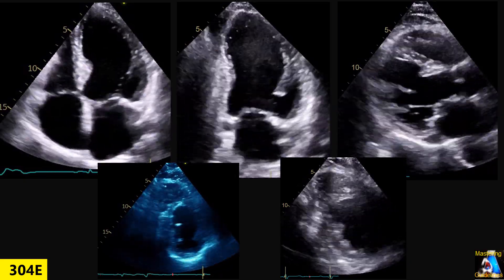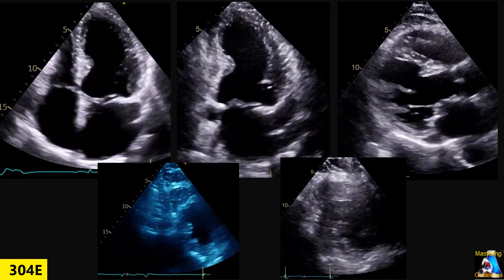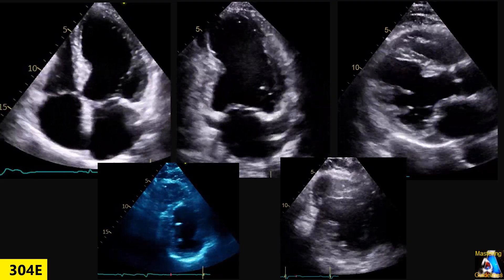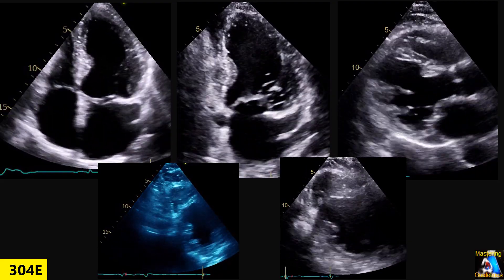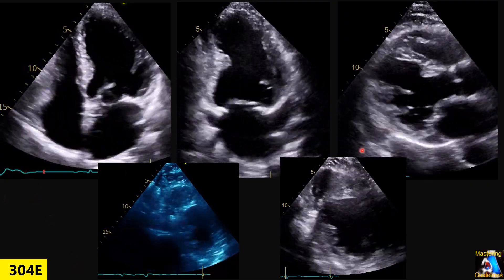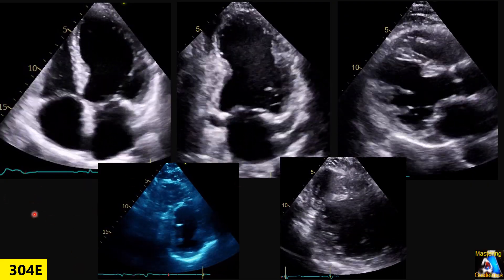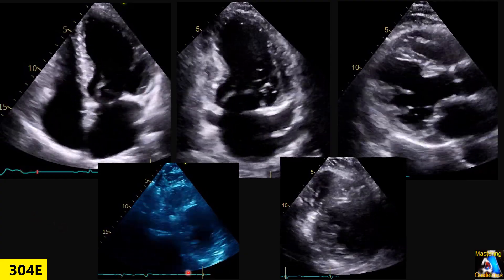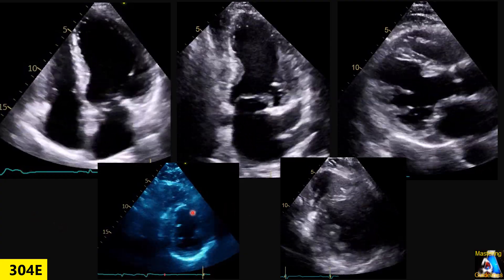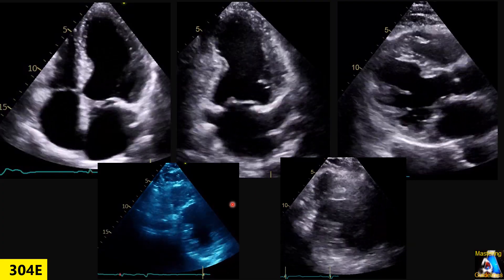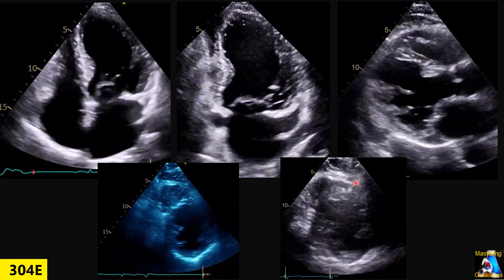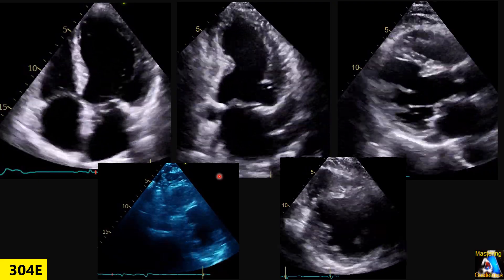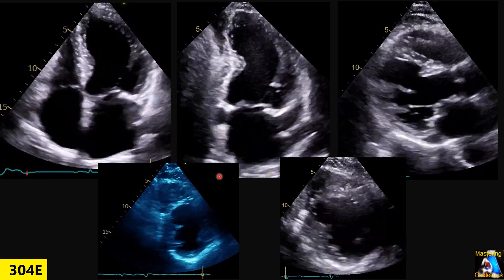The most important parameter and criteria for detecting coronary artery disease — especially in cases with bundle branch block, because they have abnormal wall motion too — is thickening of the myocardium. Whenever we have challenging and complicated cases, we have to go and find those criteria.